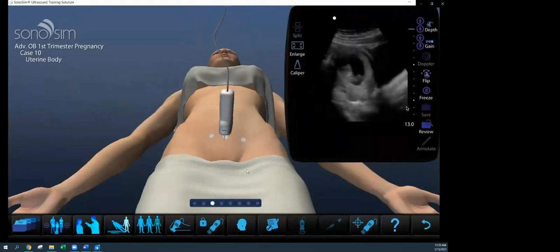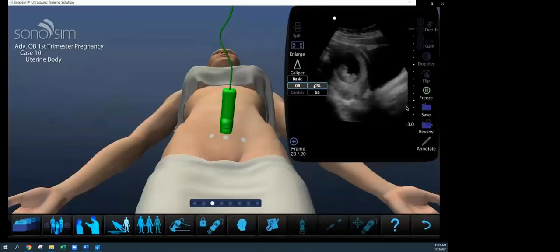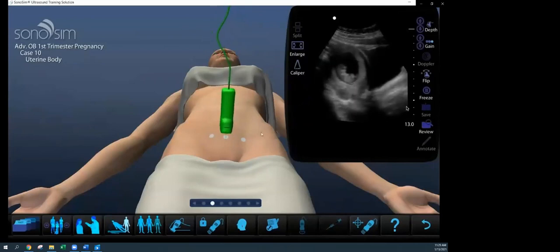As we fan through here, immediately you see the bladder, you see a pregnancy, and then if you look really carefully, you can see cardiac activity here. Remember we talked about there's a variety of different tools. I feel good that I see cardiac activity, so I'm going to freeze that image and use my calipers. I'm going to go to OB and use fetal biometry in the form of crown rump length, and measure from crown to rump. I'm going to see that this is an approximately 10-week live intrauterine gestation based on the fact that I can see fetal cardiac activity.